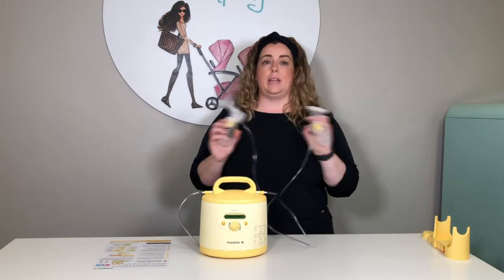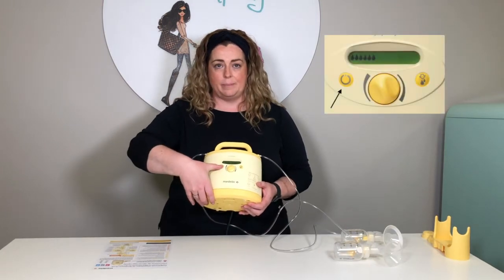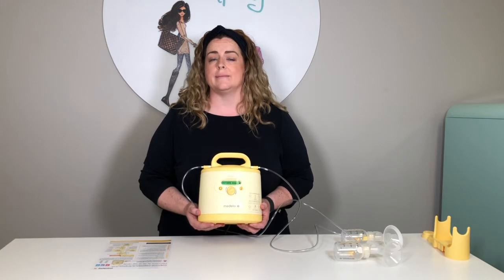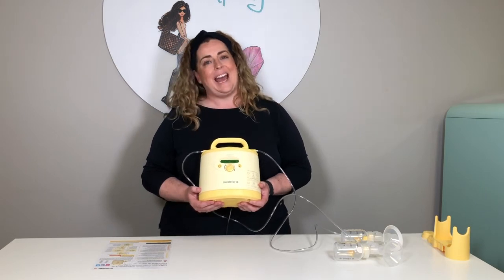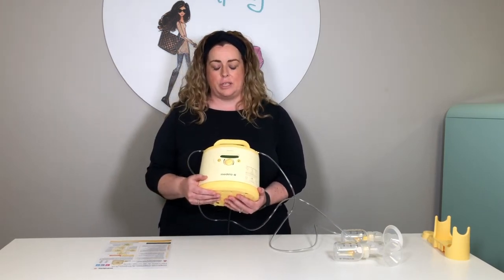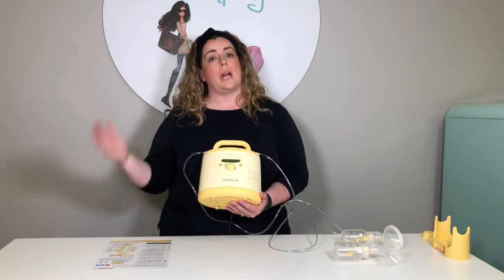Once you know that everything is good to go, then what you need to do is press the power button, which is right here, and when you turn it on, it's very, very quiet, which is one of the nice things about this pump. Now, it does get louder, but it is very nice and quiet, so it can be a little bit of a privacy benefit if it's something that you're interested in. This is your suction button right here. So it doesn't start where you left off.